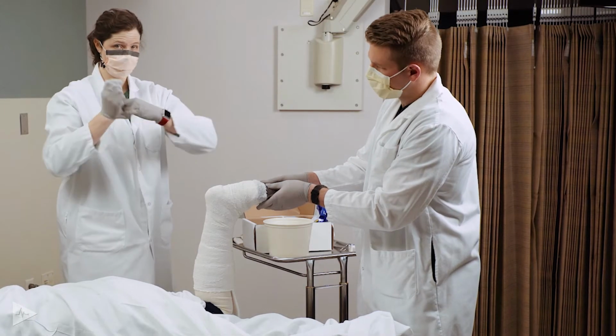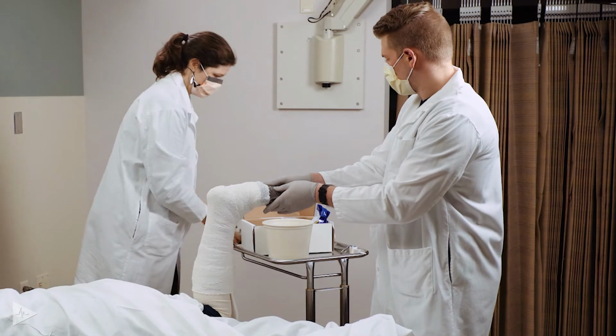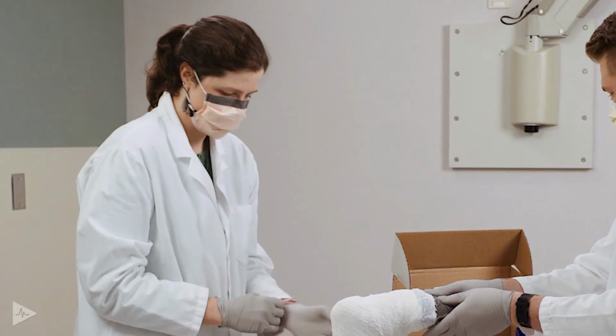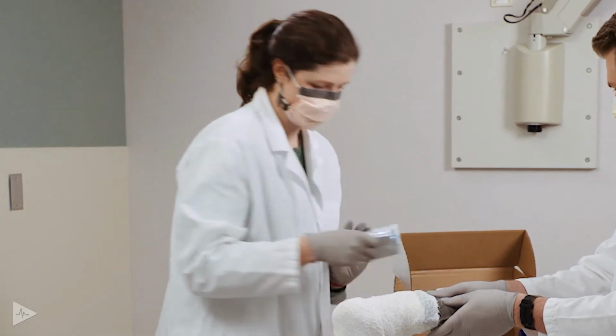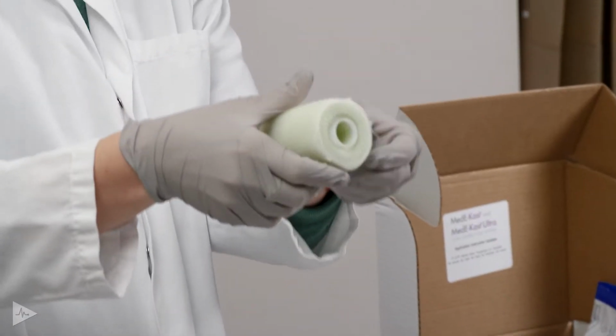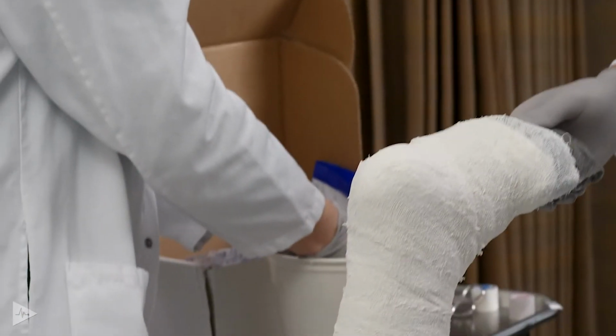And then generally I will change gloves at this point because these ones are covered in plaster. So always good to have a second pair handy. The next layer will be the first fiberglass layer, and this is the 3-inch fiberglass layer from the cast kit. Again, in roll form, you want to make sure you hang on to that leading edge. We will dunk in the water.